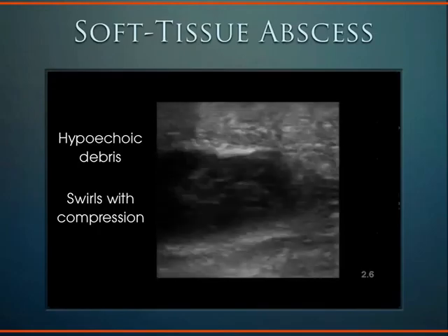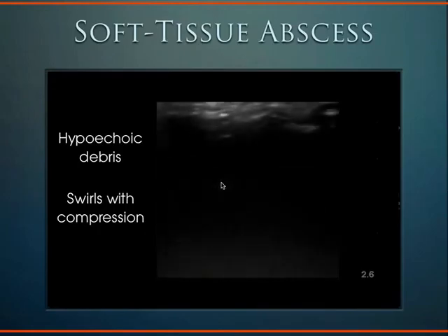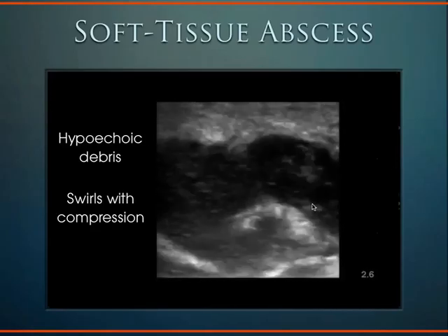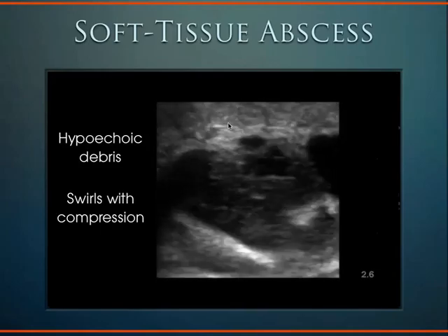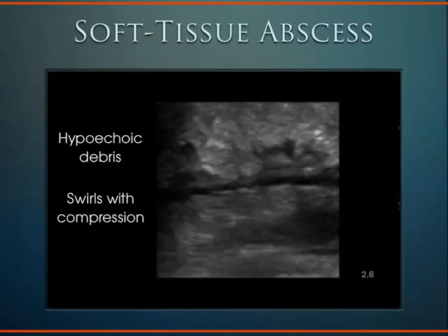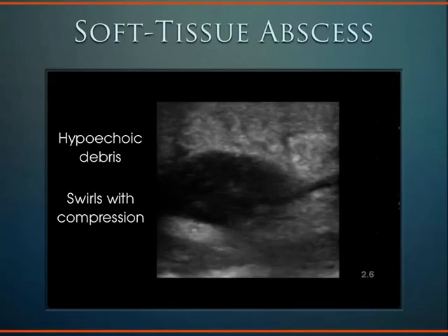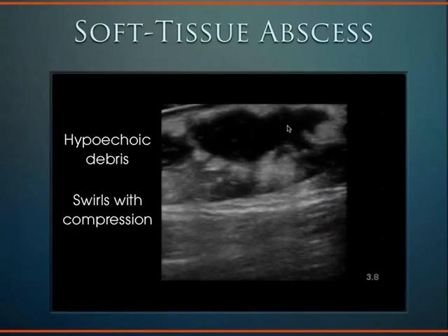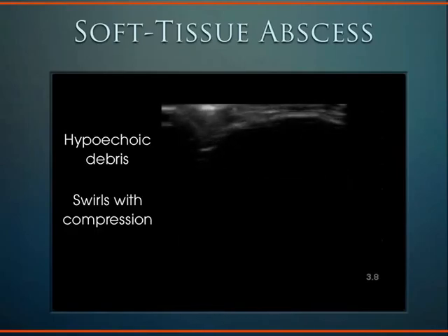Here's another example here of an abscess in this subcutaneous soft tissue. We can see, once we line it up here, we're looking for it. Here it is. We see this debris here. And so many times you see sort of some cobblestoning, but then underneath it you'll see abscess. And other times you'll just see abscess without any subcutaneous soft tissue cobblestoning. Lots of examples of these. These come in all the time. We can see another example here of abscess material in that superficial soft tissue.